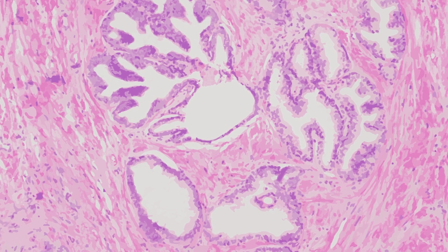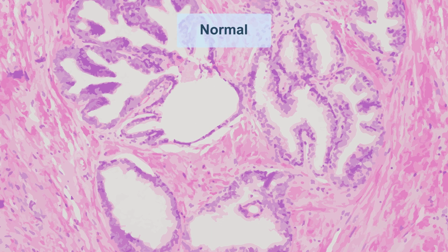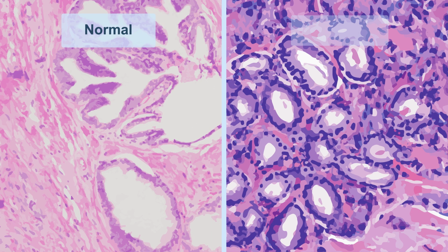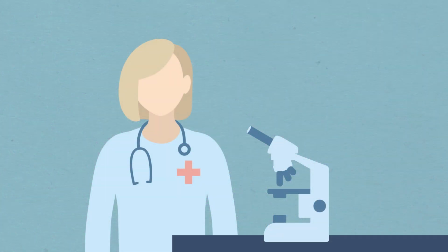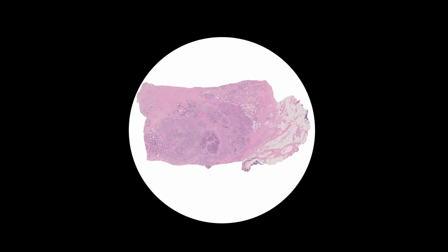Human tissues are comprised of incredibly intricate, three-dimensional biological entities, from benign cells and structures for a healthy person to cancerous cells, glands, and tumor microenvironment for a cancer patient. For over 100 years, pathologists have been diagnosing cancers and diseases by examining thin, two-dimensional tissue slices cut from an excised tissue specimen during biopsy.